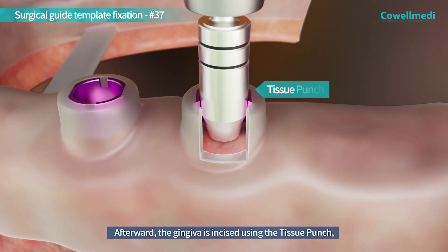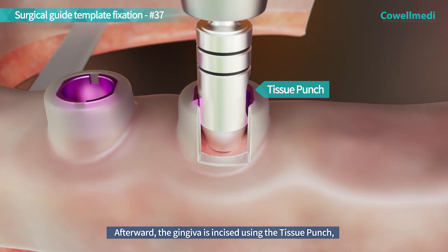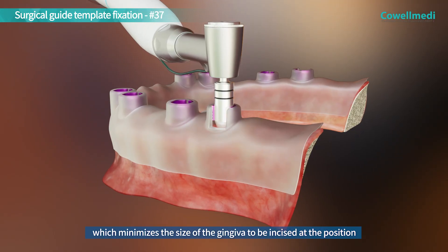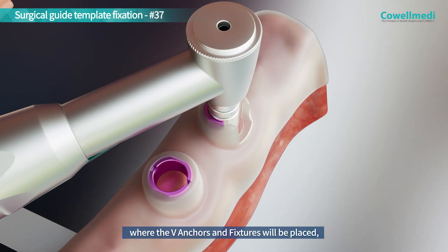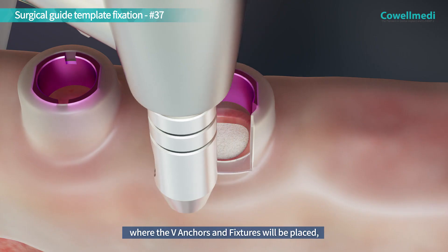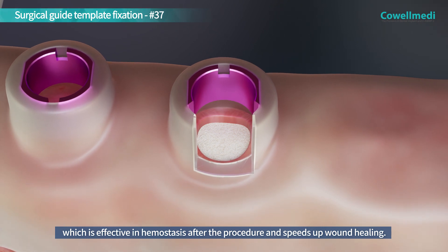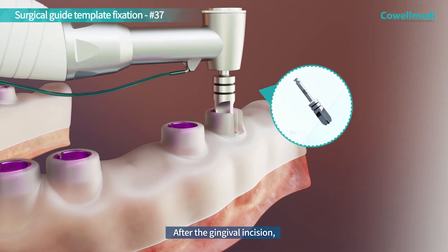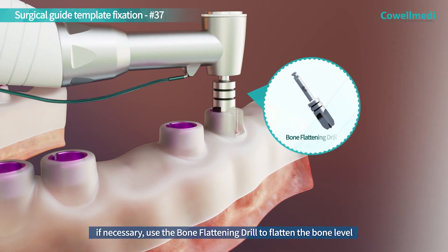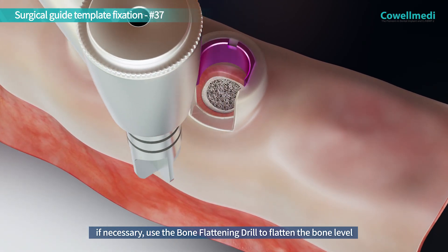The gingiva is incised using the tissue punch, which minimizes the size of the gingiva to be incised at the position where the V-anchors and fixtures will be placed. This is effective in hemostasis after the procedure and speeds up wound healing. After the gingival incision, if necessary, use the bone flattening drill to flatten the bone level.